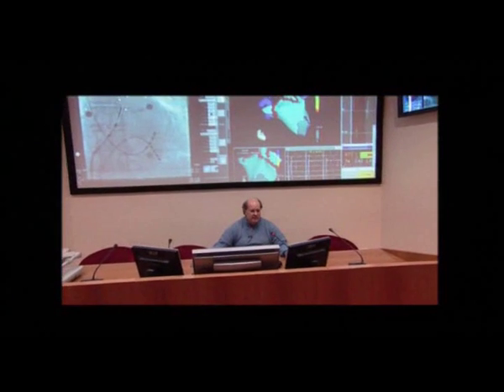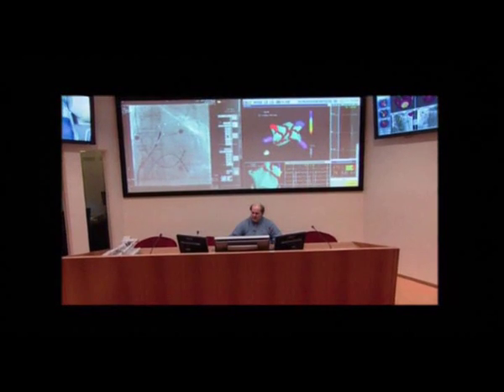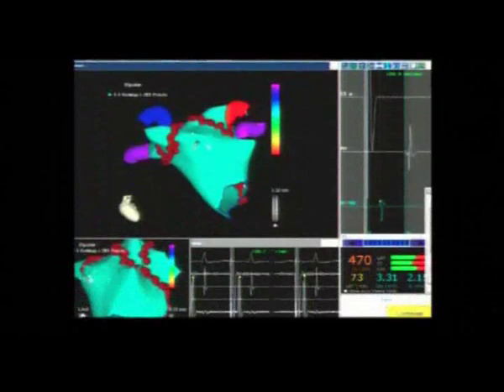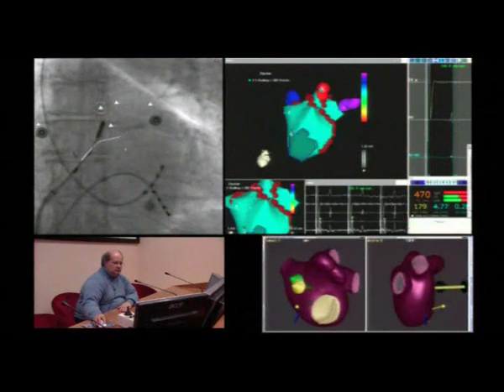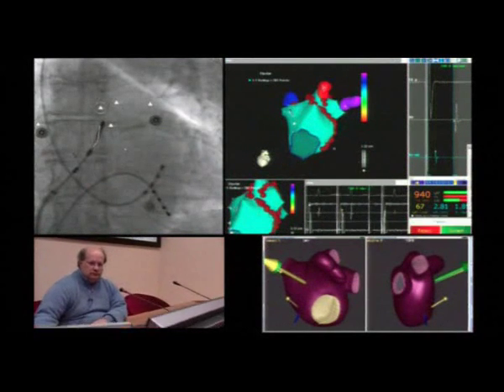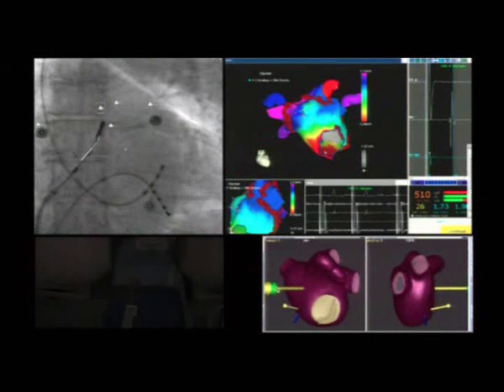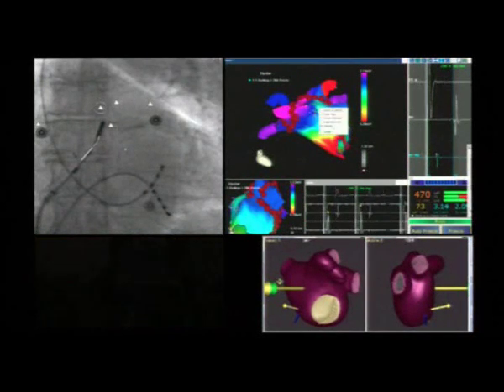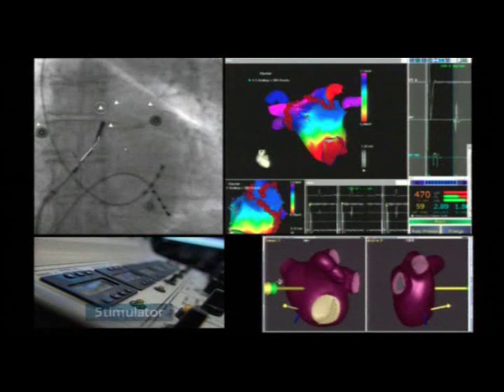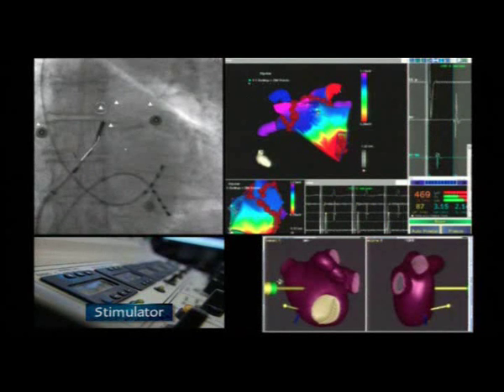Filippo, are you ready? I want to verify the continuity of the line. The remap phase assesses the acute electrophysiological modifications. As previously stated, the endpoint of this approach is voltage abatement greater than 90% on the ablation lines and inside the ablation area.